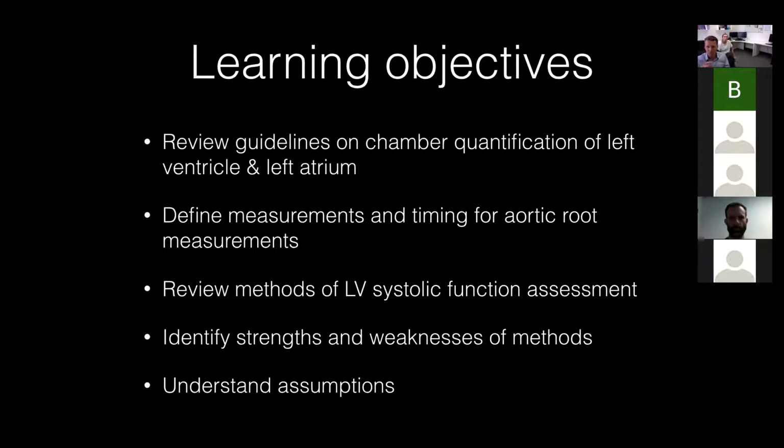So I think particularly with LV size and function, it's important that we know how to measure it accurately. We know how to communicate efficiently, because when we're talking to cardiology colleagues, they're going to want to know that the measurements we're making are accurate. That means they're reproducible, so that you can compare when someone's been in ICU to when they're on the ward, and also enables us to communicate efficiently, because things like ejection fraction can be really important from a cardiologist's point of view. It can help determine whether you're going to be sending someone for a valve replacement or not, if it meets up with symptoms, for example. And so we've just got to make sure we're measuring it properly.